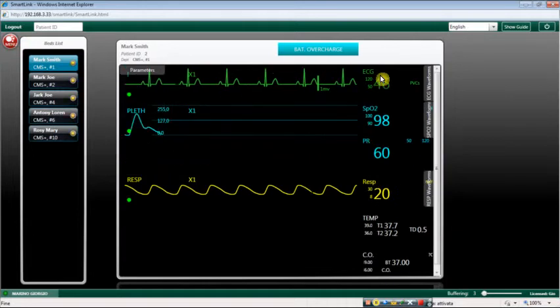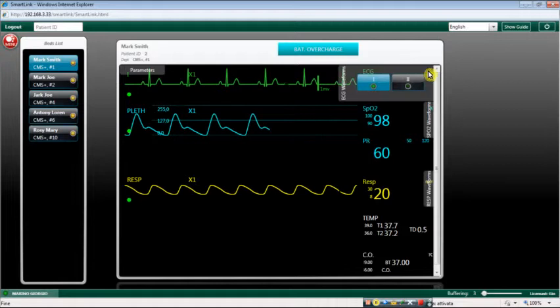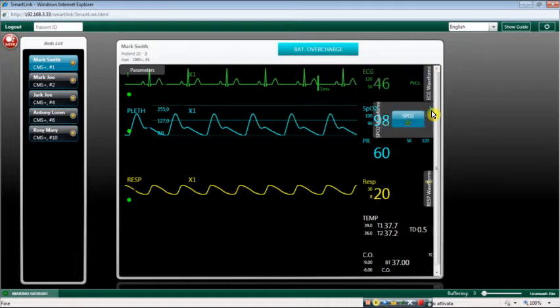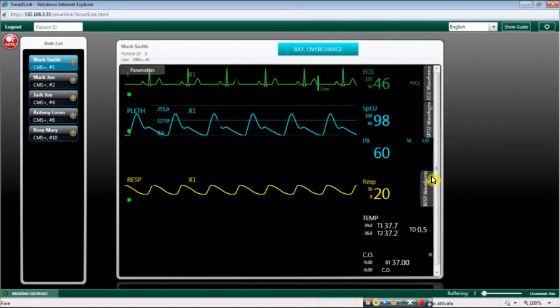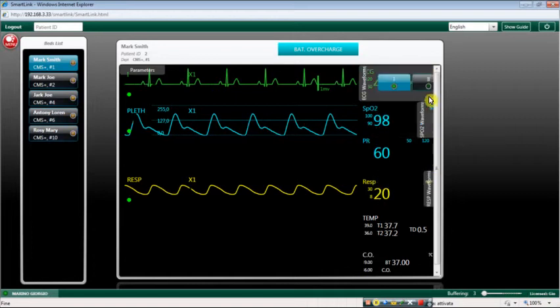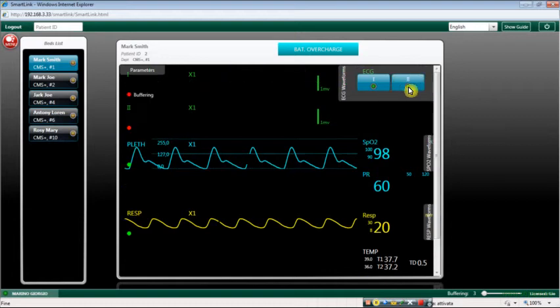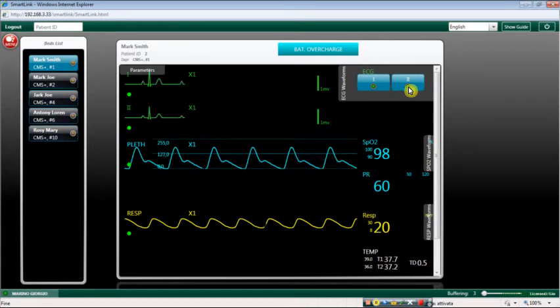When waveforms are available for a displayed parameter, a grey label appears beside the parameter value. Move the mouse on the grey label to open the waveforms list. The available waveforms set depends on the selected monitor and its configuration.